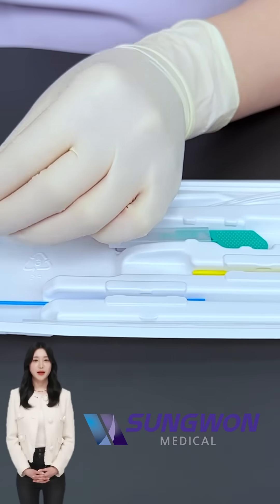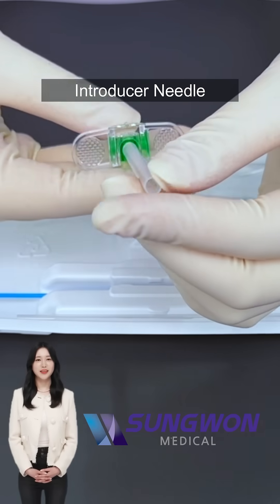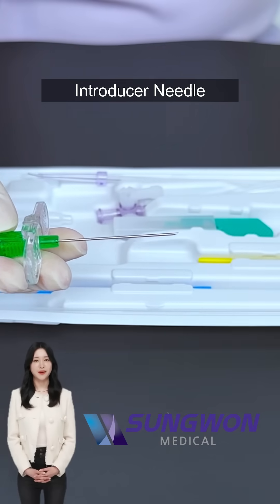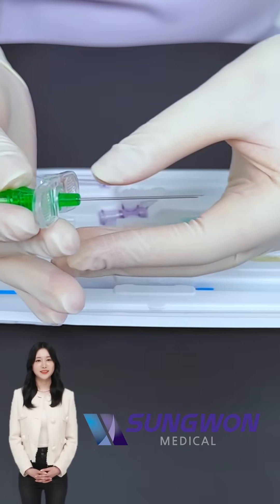Next, we have a large bore introducer needle, commonly with a handle. This needle carefully punctures the artery or vein, creating the initial access route. Its ergonomic handle gives the operator better control while advancing through tissue.